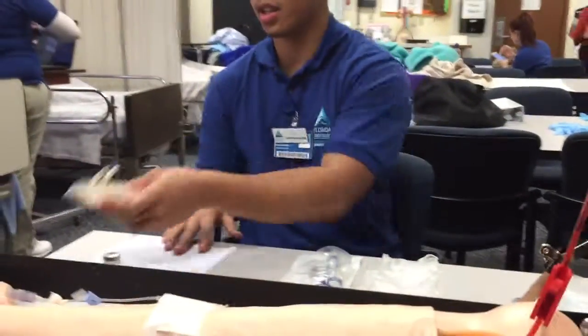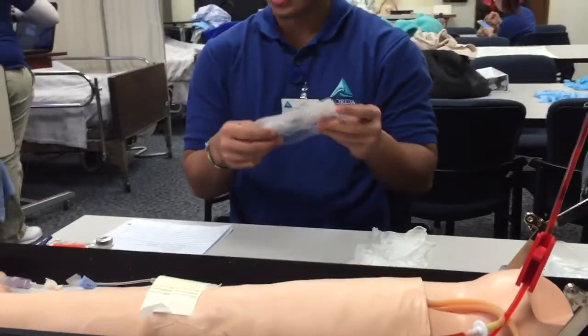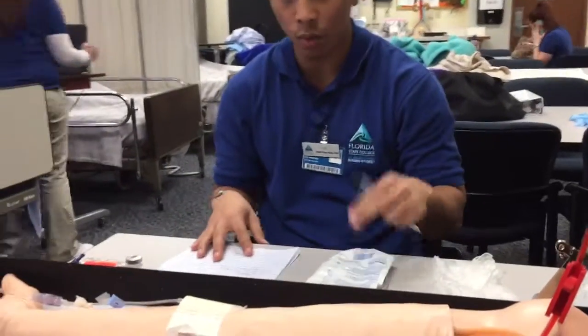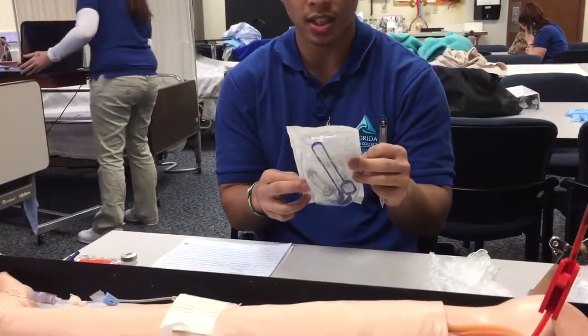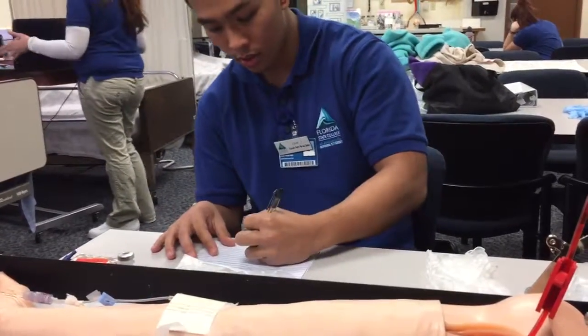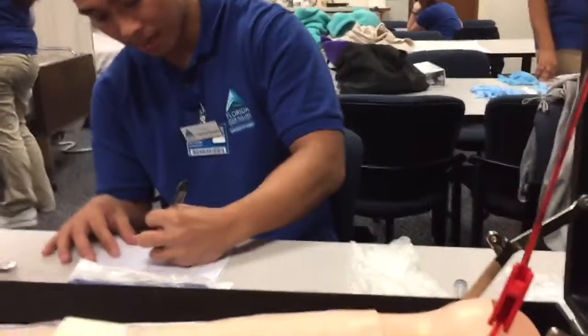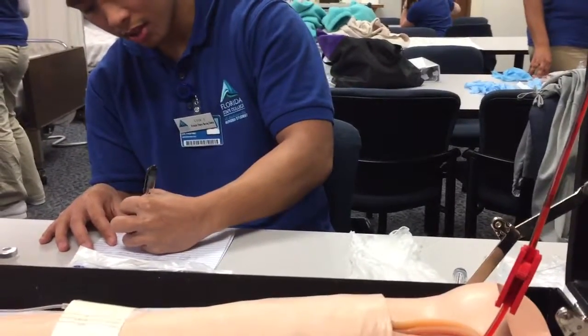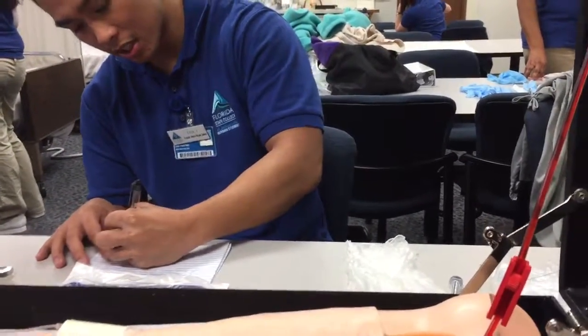This is ready. Now this is the tubing that I'm going to use for the piggyback. I'm going to do the calculations for this also. The piggyback is set to run over 1 hour, and the drip factor is 10 drops per milliliter. So we're going to do the 100 milliliter mini bag divided by 60 minutes, which is 1 hour, times the drop factor, which is 10, and it comes out to about 17 drops per minute.